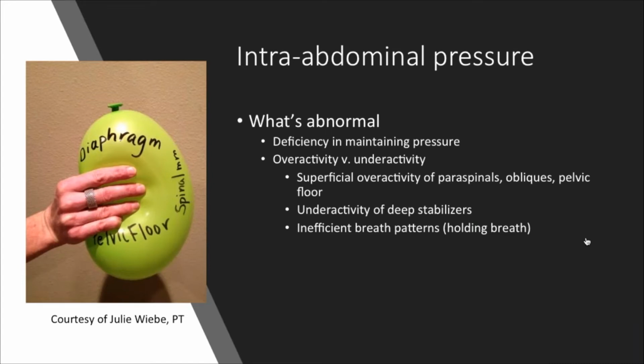And as Megan mentioned, we really have a lovely opportunity by visualizing the pelvic floor and understanding what a contraction or relaxation looks like, being able to visualize if there's any overactivity of the obturator internus with that indentation towards the bladder, what the normal muscular strategy is for the muscles in this region.